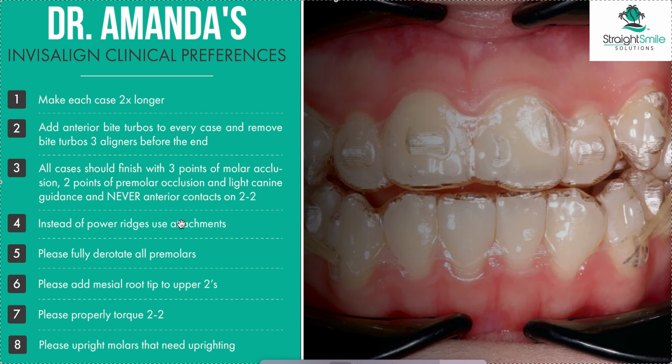Number 4, no power ridges. I hate power ridges. If you don't know why, search by keyword power ridges. I'm not going to go into that. Hate them, don't want them. Sloppy, unpredictable, and annoying to the patient. They hate them. And lazy.